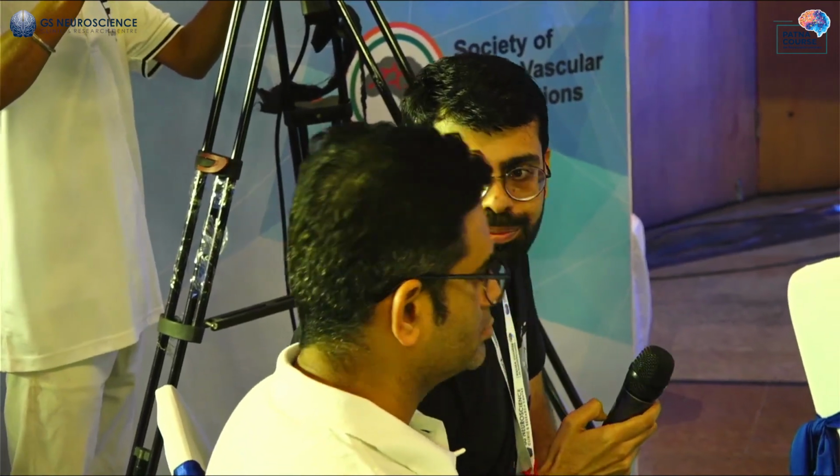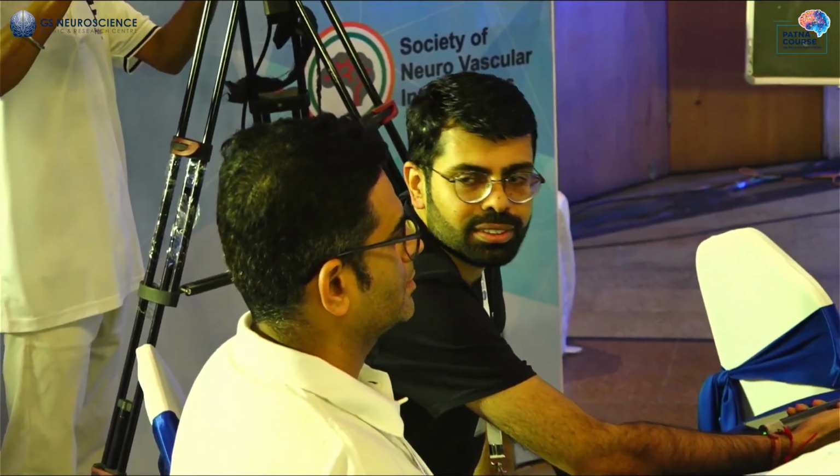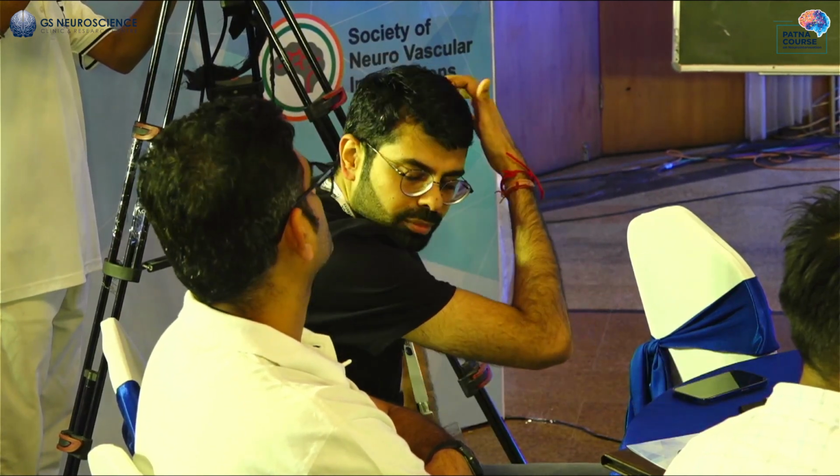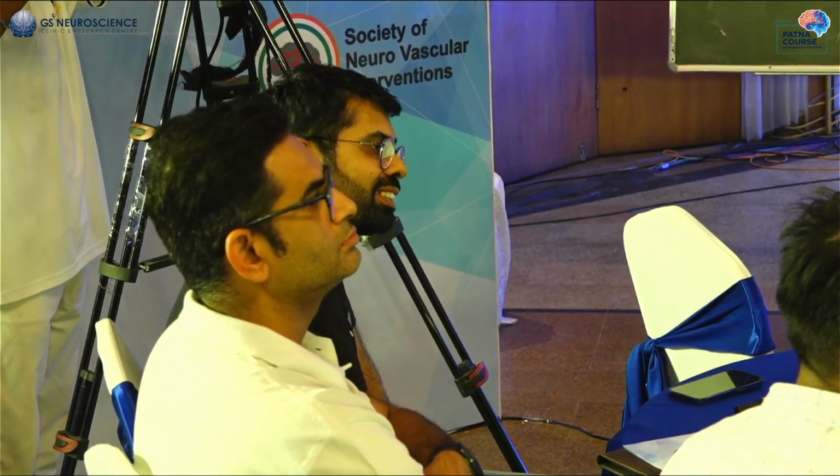Agreed, but most of the time in this indirect CCF, they use a short sheath and they just go through the inferior petrosal and just put coils. They don't use liquid embolics in most of the cases. If you have a very good inferior petrosal, you can do that. But very often the inferior petrosal is thrombosed, then you have to drill it, then you have to take the reverse end of a wire and poke it. So if you have a good arterial access, why not?